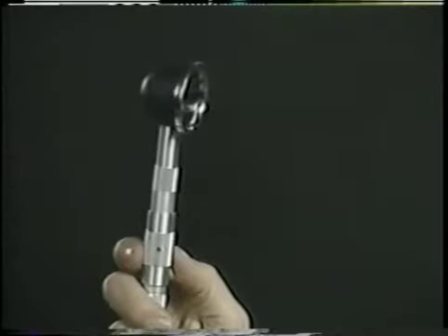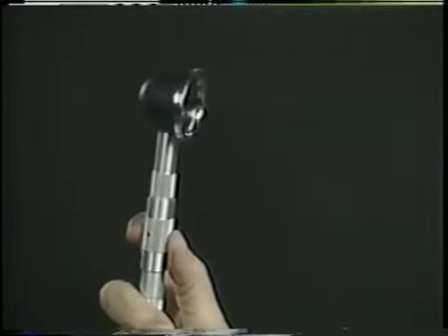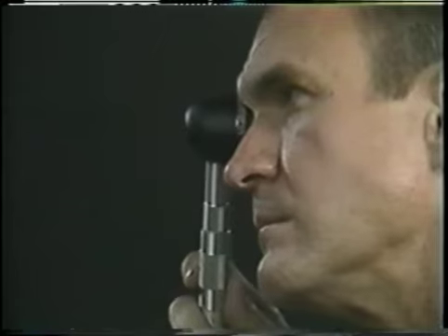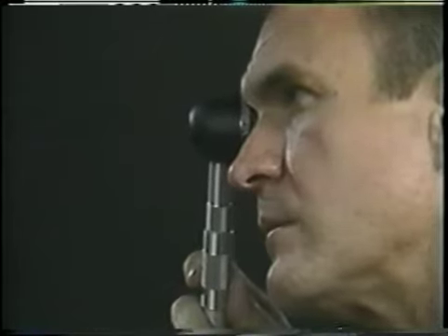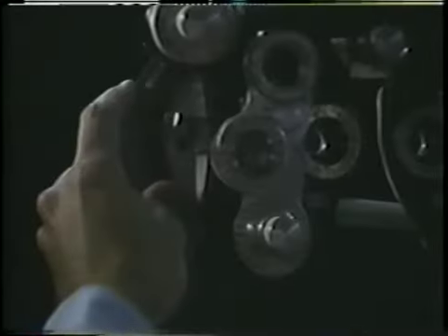The retinoscope should be held with one hand, using the thumb and forefinger to hold the sleeve in the up position and to rotate the sleeve when necessary. The rim of the scope should be steadied against the brow, with the examiner looking through the peephole at the eye to be retinoscoped. As with direct ophthalmoscopy, the examiner's right eye is used to retinoscope the patient's right eye, and the examiner's left eye is used to retinoscope the patient's left eye. With the room lights dimmed, the blurred streak of light, the intercept, is swept across the pupil.